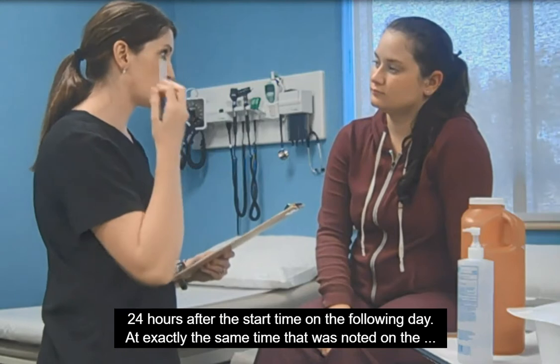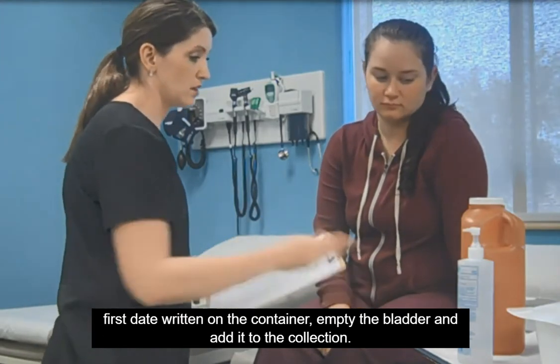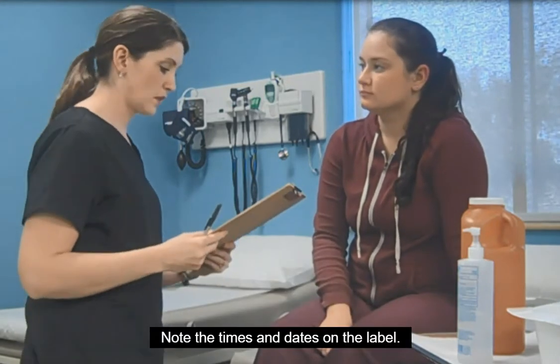At exactly the same time that was noted on the first day and written on the container, empty the bladder and add it to the collection. Note the times and dates on the label.